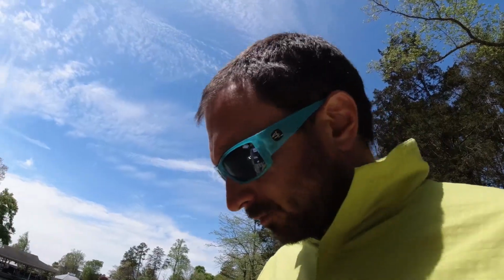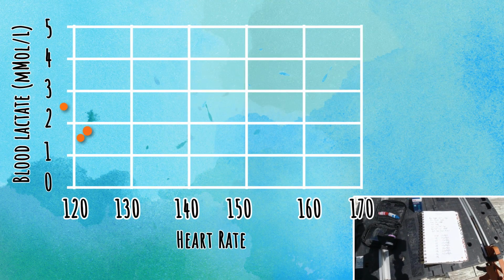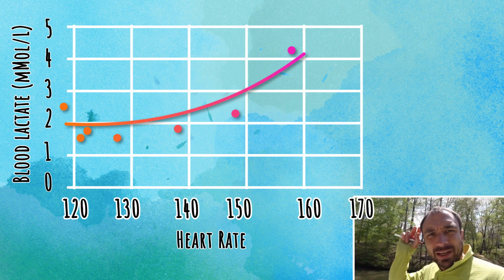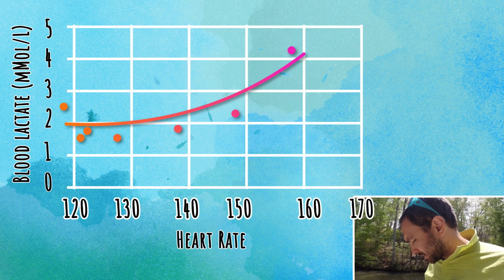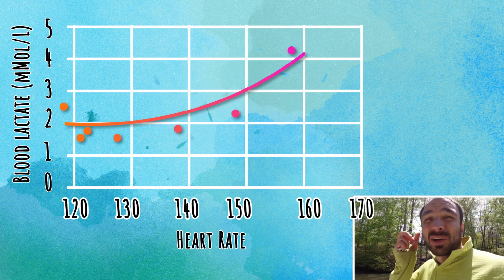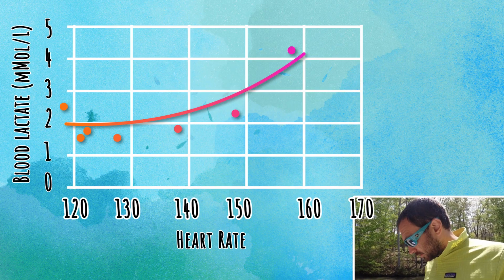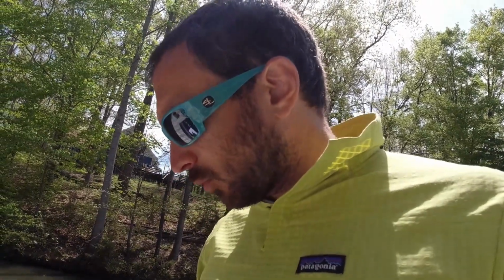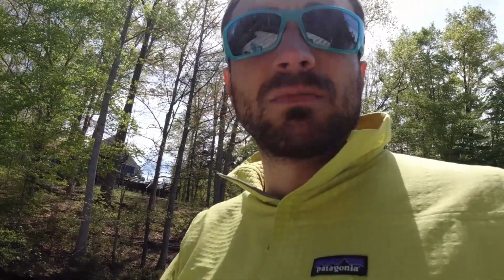I'm on the 6th or 7th test right now. 7 tests. We pretty much ranged from 118 during her warm up to about 158, which was the last reading at 4.2, and so we're gonna do another reading at 158. This might be kind of like the threshold. Your threshold's normally around 3 according to literature. So yeah, we're gonna do that again, and that might be it for the morning. So exciting news. She's a little bit of a high reading at 118, but it might be just a little bit of catching it too early in the warm-up, but see how it goes.